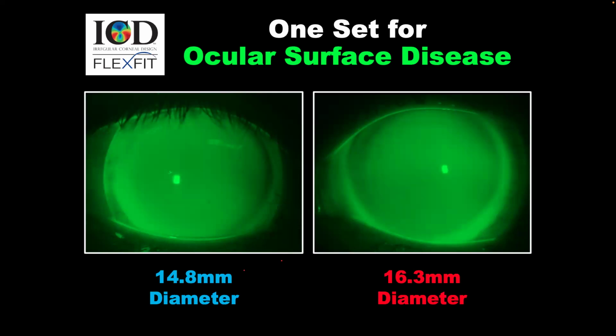Yesterday I was in a meeting where they suggested putting a drop of gel, making it more viscous. That's a good thing to do. I usually go with hyaluronic acid of 0.4 concentration, and that works as well.